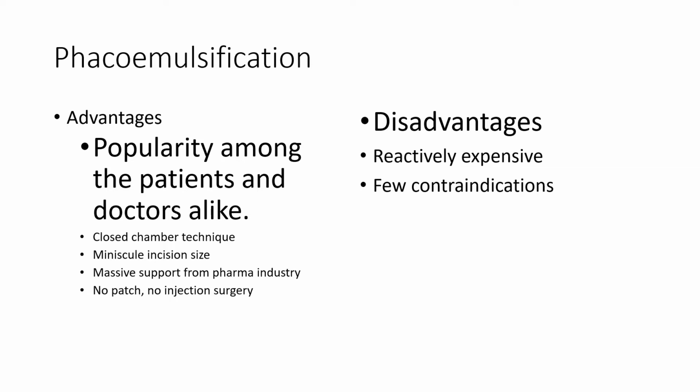Now when it comes to the disadvantages, it is relatively expensive and it has few contraindications where rest of the techniques come into play.